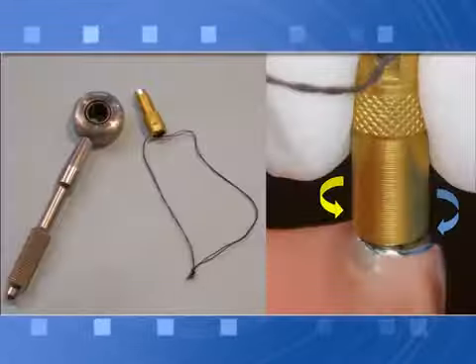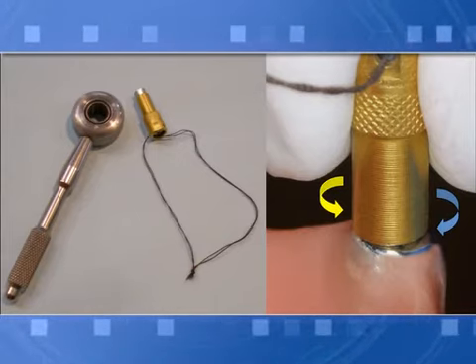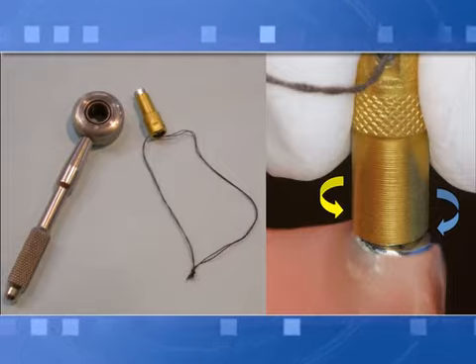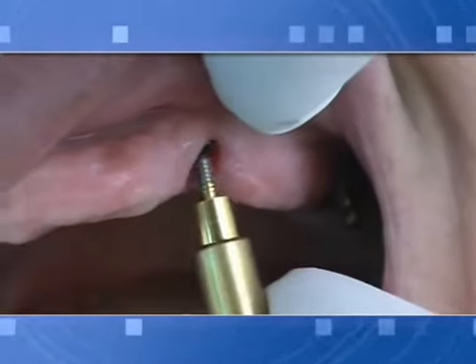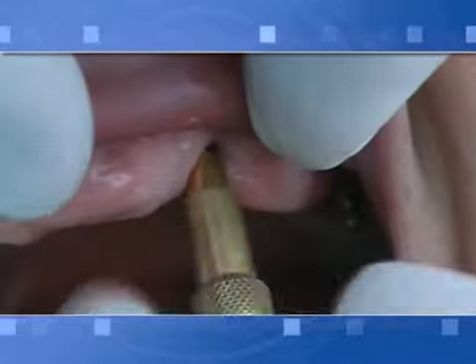When screwing the new abutments into implant threads, always tighten manually and unscrew first, repeating this procedure at least 3 to 4 times in order to adapt the implant thread to receive the new abutment screw. The abutment screw is adjusted in this way to the implant thread without use of any additional tool, with very good stability.